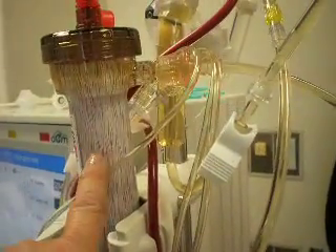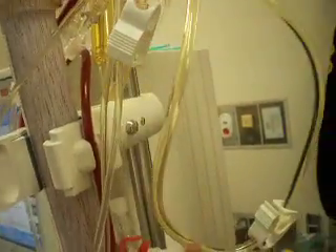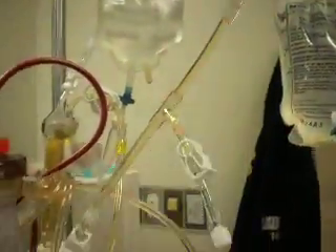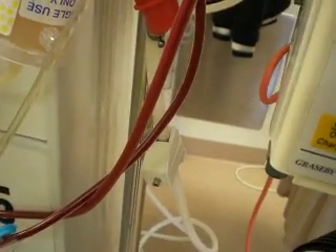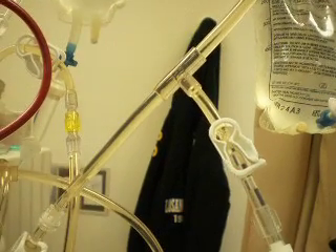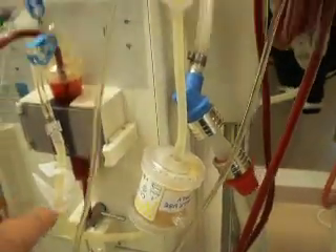This is the plasma filter where patient's plasma has been filtered out. It goes into the anti-contamination chamber here. This anti-contamination chamber usually drains into the dialysis port on the dialysis machine, but with this glycosop column that we are using, we're actually returning patient's plasma back to the patient after it's been filtered, after the plasma has gone through the glycosop.